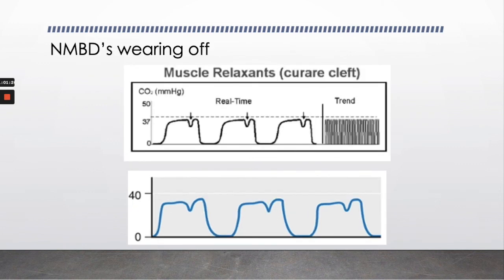Okay, so this one, we see some spontaneous breaths that are occurring here. This is more commonly called the curare cleft. If you look in phase 3, you see that dip right in here, and that's a patient just taking a spontaneous breath during mechanical ventilation.